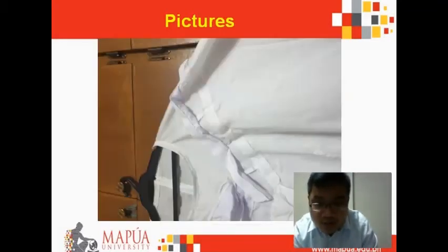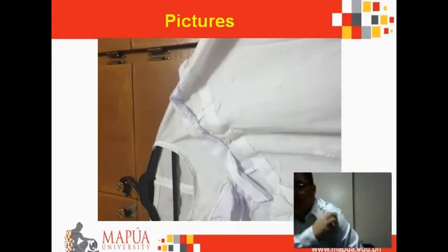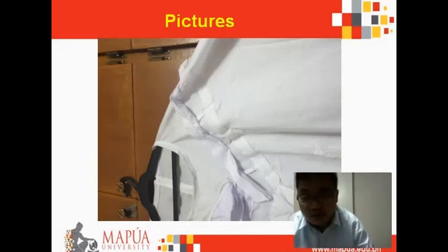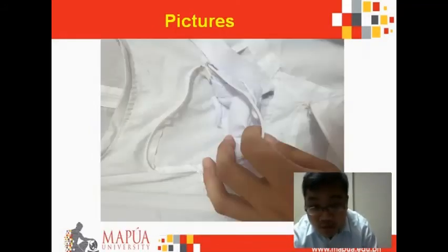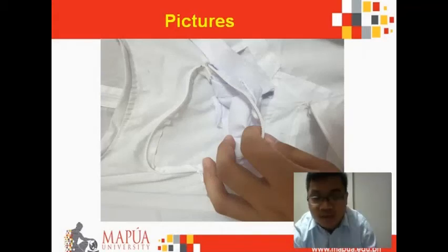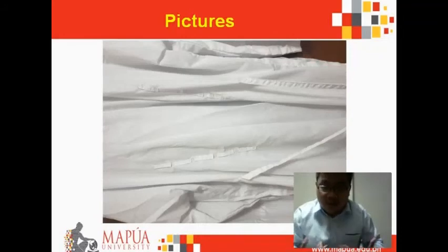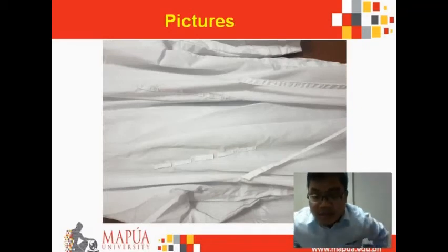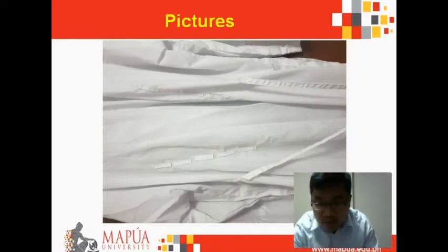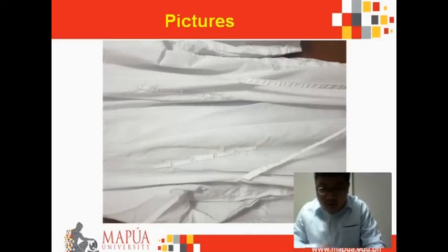And the holes for the wire management, the Velcro which travels from the shoulder up to the arms to the SpO2 as seen here. And of course we have the mini pouch for the wire management, as I said earlier, and of course the back of the said whole clothing, which we can see here, in which we can mount the said belts. Of course, different people have different heights or distances from the chest to their abdomen.